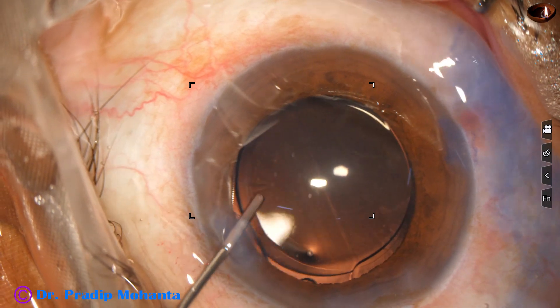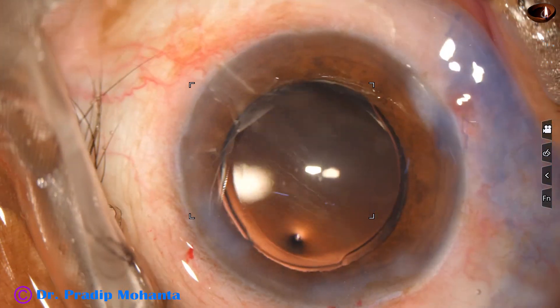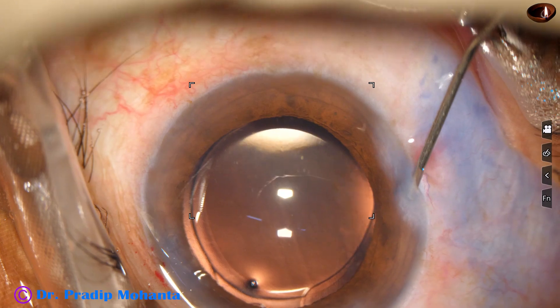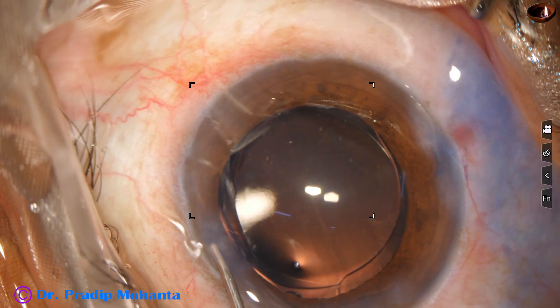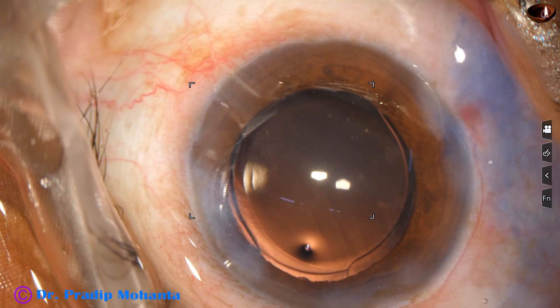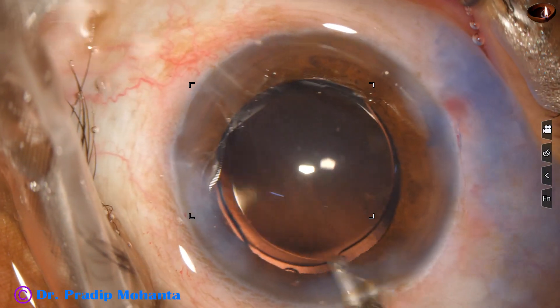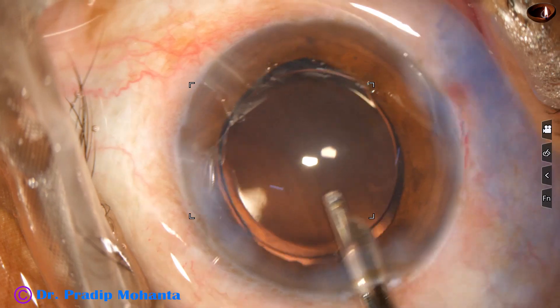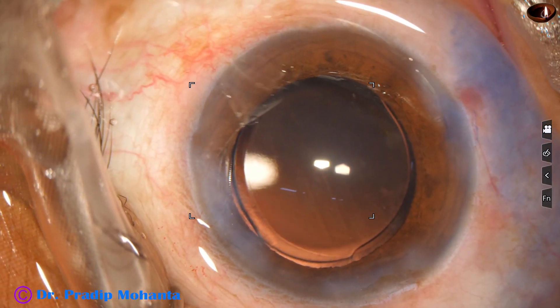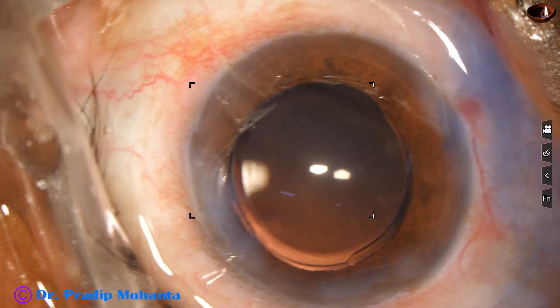We can see by the round shape of the rhexis that the lens is well positioned. The side ports are closed by hydrating the corneal stroma on either side of these stab wounds. This is the final lavage of the anterior chamber — nicely formed. Integrity of all wounds is checked and the case is concluded.